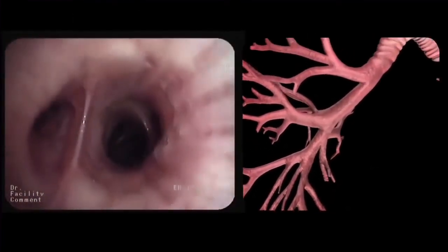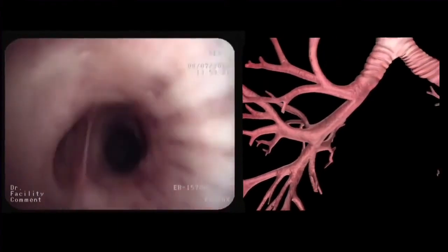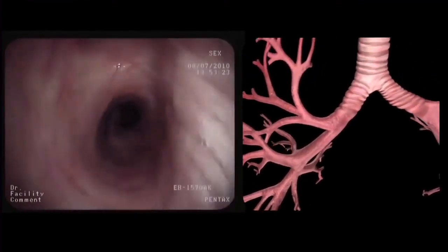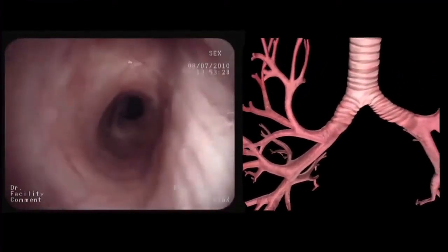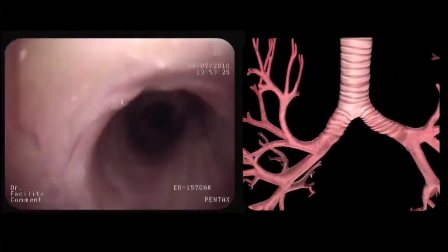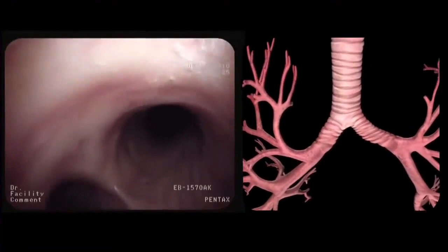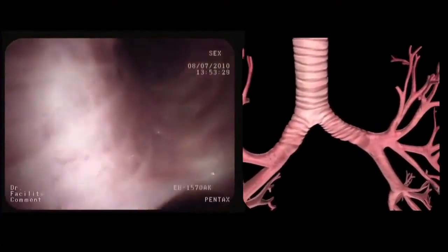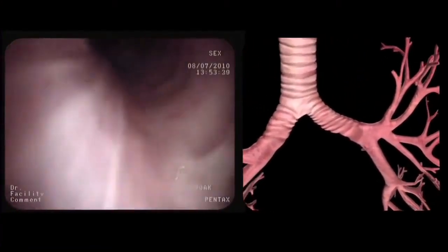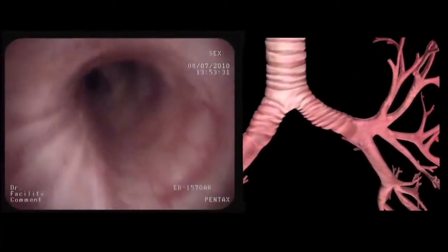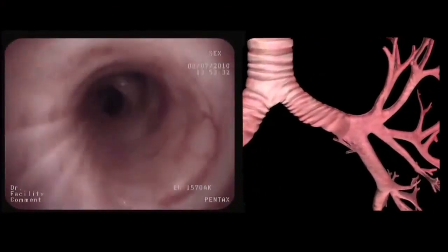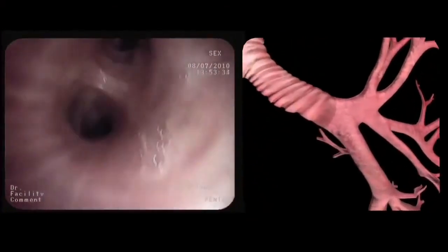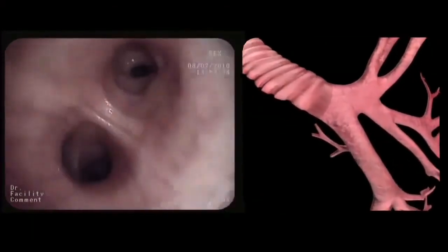After inspection of the basal branches, the bronchoscope is then slowly retracted up to the level of the main carina. After rotating 90 degrees counter-clockwise, we enter the left main bronchus, which is significantly longer than the right main bronchus.